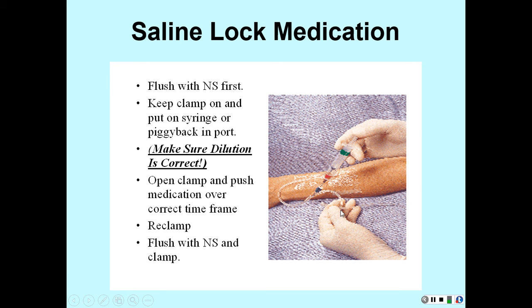So clamp your tubing and push your medicine in, and then unclamp it. Now when you clamp this right here, your IV thing's going to beep. Okay, it may beep if you keep it clamped for any length of time. You'll see nurses do that, and that's why they do it. If you're giving it slow enough, you may not need to kink it off, but it's okay to kink it. It's all right. It won't hurt you.